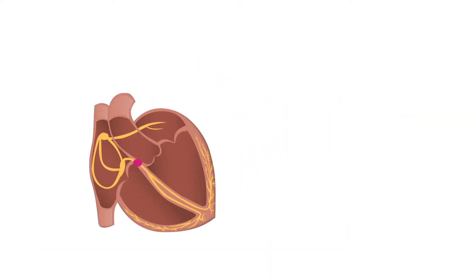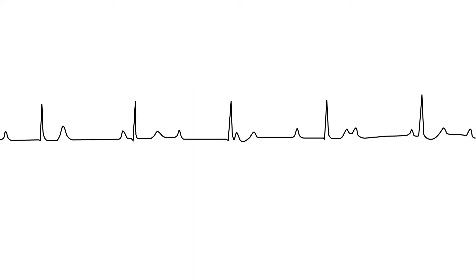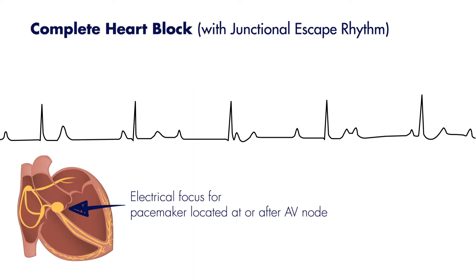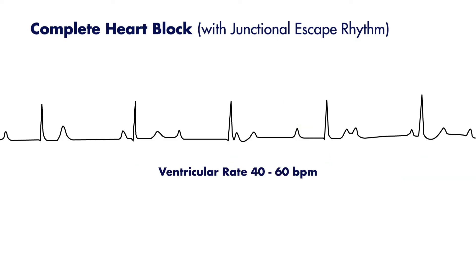Instead, the ventricles inherently fall back to another pacemaker. This will either be a junctional or ventricular focus. Here's an example of a junctional escape rhythm in a complete heart block. Note the dissociation between P waves and QRS complexes.